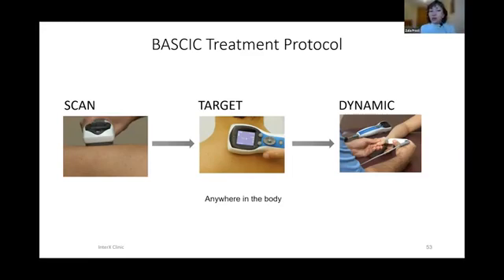On the stomach, for example, you scan the gut, and then you find your active sites, you circle it with your eyeliner pencil. Now you know you're going to focus on this. Then you target each of them. You read first out of 3 readings, then you target.